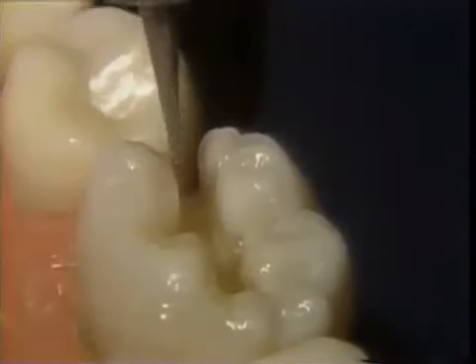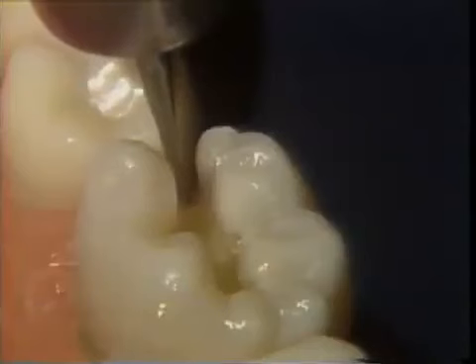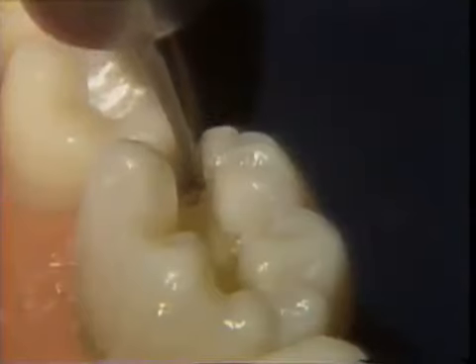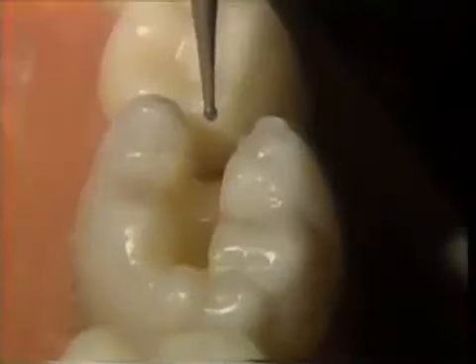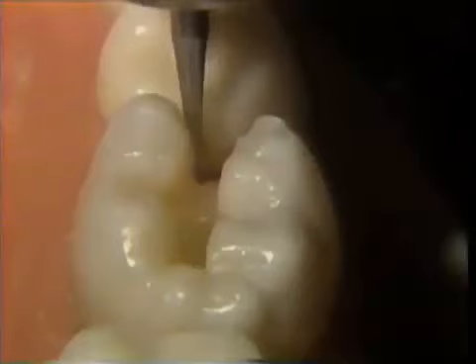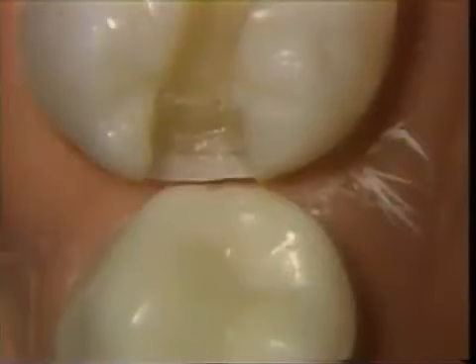A number 1/2 round burr is used to place round retention in the proximal walls. The burr is placed 1/2 its width into dentin, just inside the dento-enamel junction at the cervical floor, and is stroked occlusally to the height of the pulpal floor. This prepared cavity is now ready to receive the restorative material.